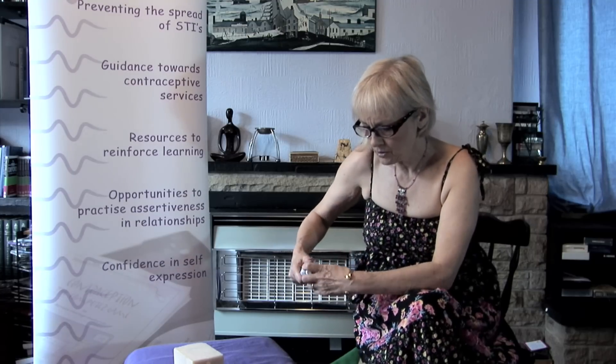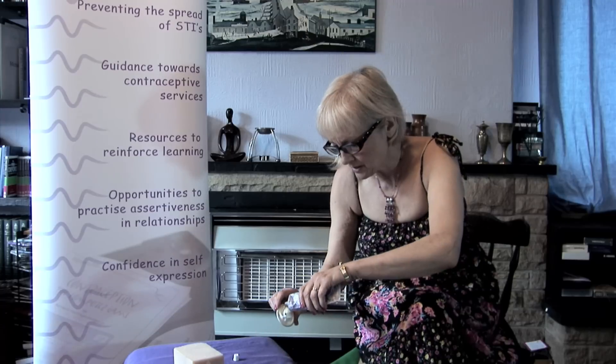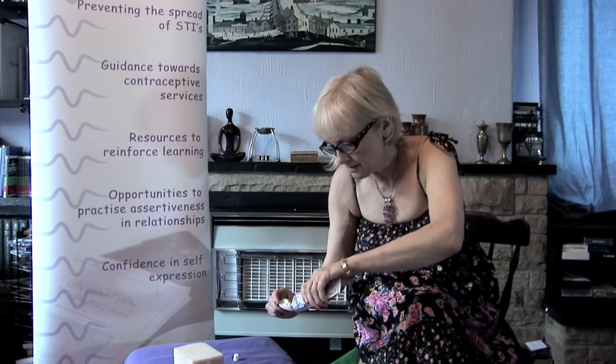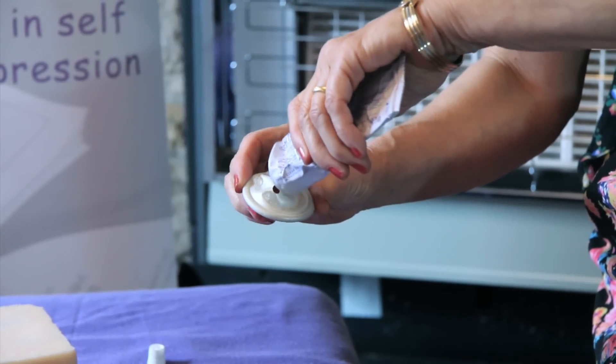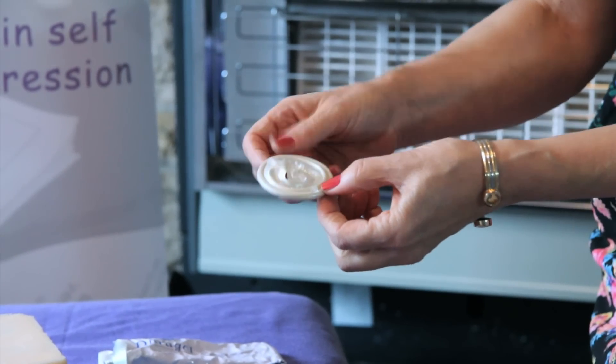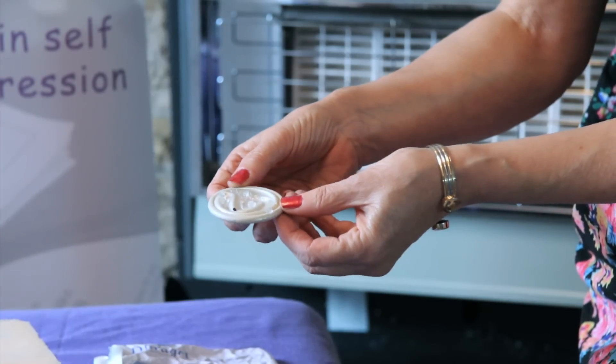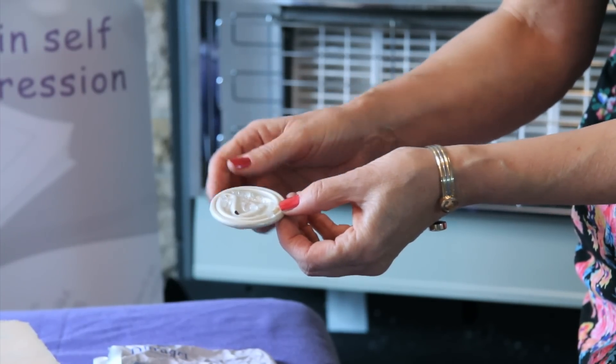So this is a diaphragm, and what we're going to do is put a little bit of spermicide around the outside of it, like this, and a little bit of spermicide down the middle. If any sperm do get through around the outside of the diaphragm, that will kill the sperm.